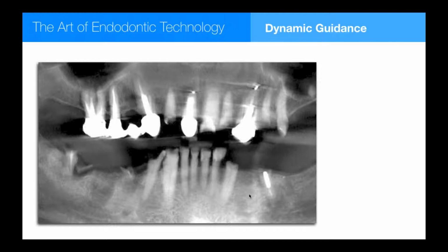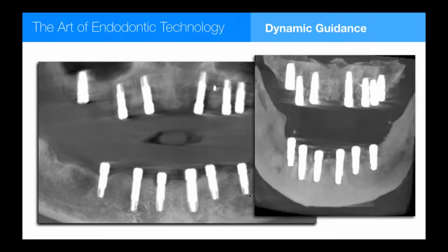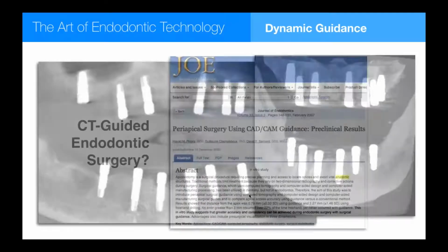I tell my colleagues, when you start out doing implants as an endodontist, you'll probably expect what you'll accomplish in the first year or two, but you'll be a little surprised at what happens at 5 years. And like me, you'll probably have somebody refer you a 12 implant immediate full hybrid denture case. And while these aren't the cases I prefer because they're so much work, being able to put 1 to 4 implants in perfectly with a drill guide is everything.